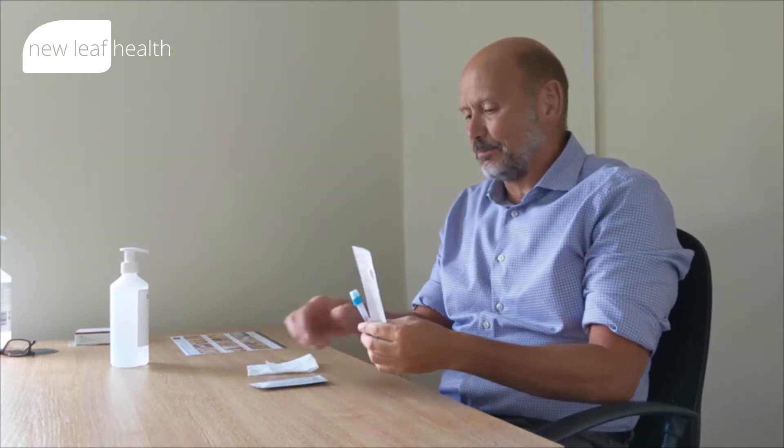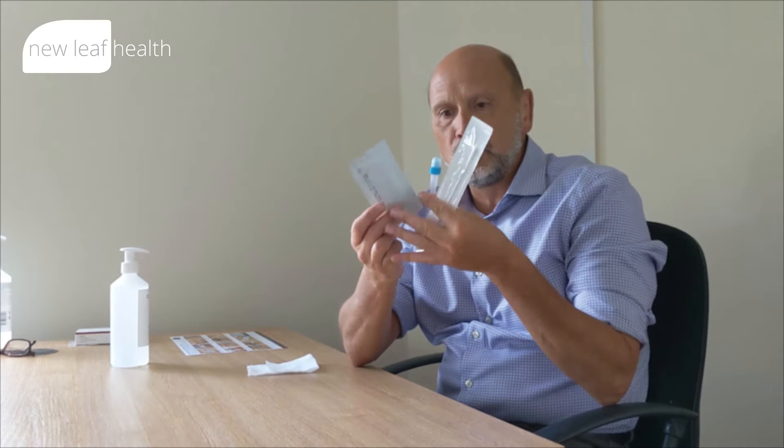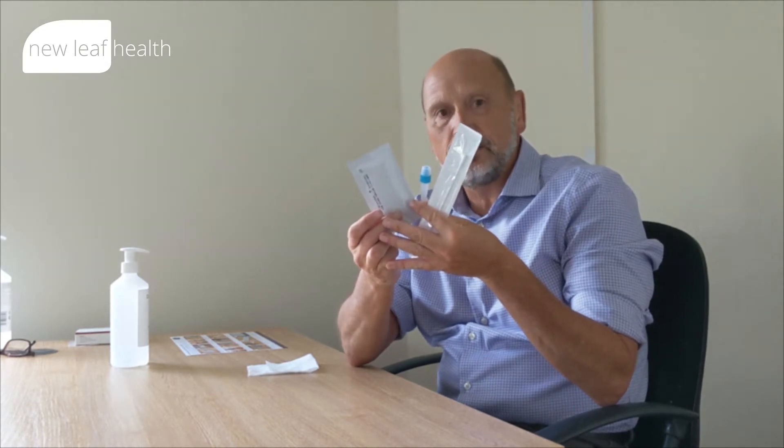Hi, Andy from New Leaf Health here. I just want to take you through the lateral flow tests that we're recommending to our clients at New Leaf Health for protection against COVID-19. The reason why I'm demonstrating this to you, you'll see the simplicity of using the FlowFlex test, particularly compared to some of the free tests that have been made available to us all in recent times.